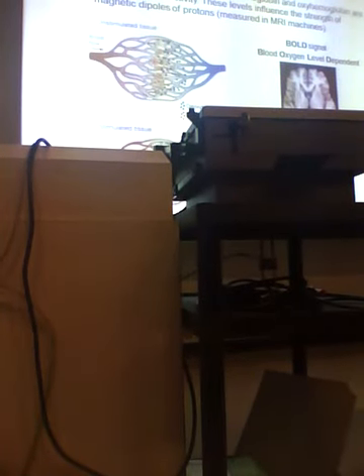The way this works basically is that the signals the MRI gets depend on the ratio of deoxyhemoglobin to oxyhemoglobin. These orange dots here are meant to represent the neurons, and this is in the unstimulated tissue. When the neurons become active, stimulated, so now they turn red, there's an increase in the ratio of oxyhemoglobin to deoxyhemoglobin.